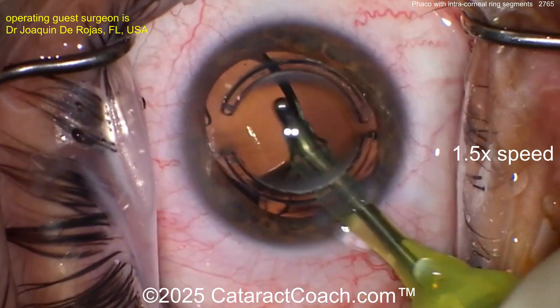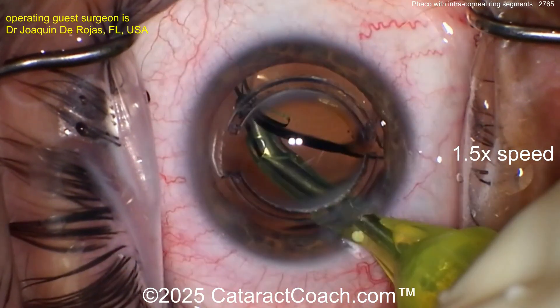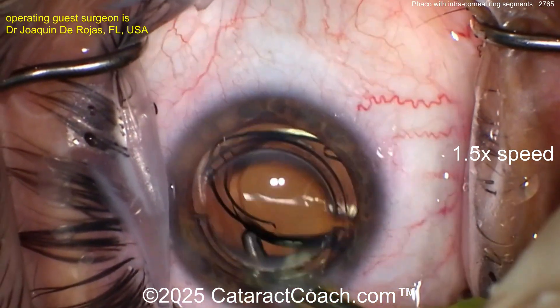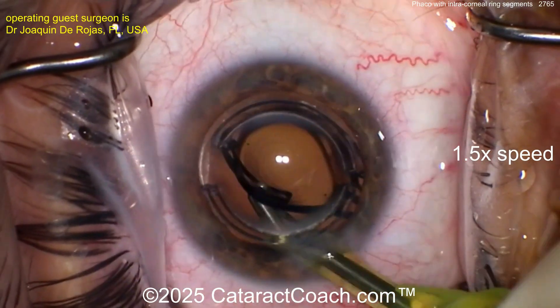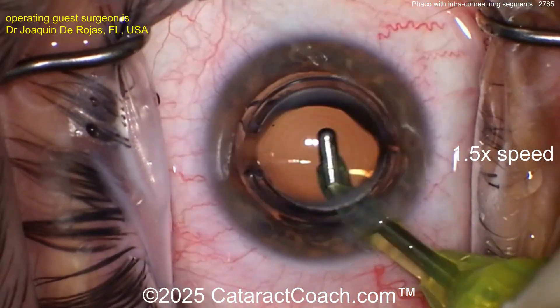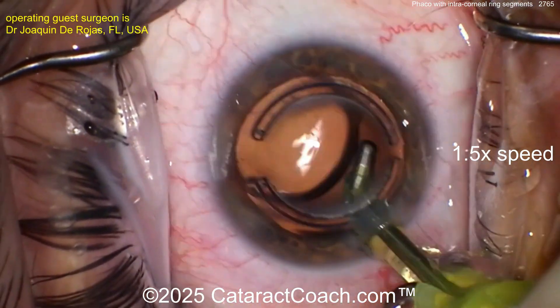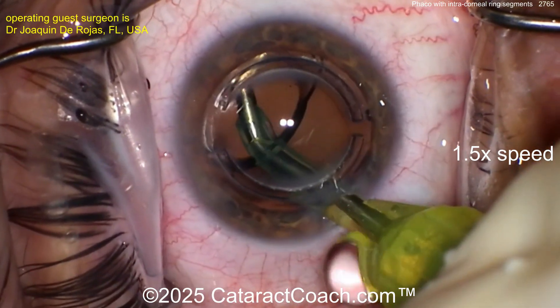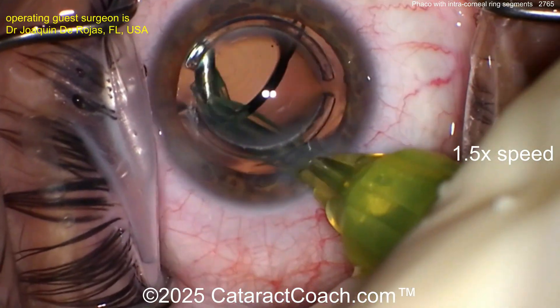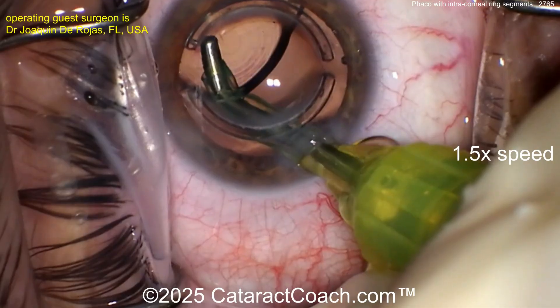Now, what should you do if you decided to take out the ring segments? You would remove them in one procedure, then wait — let the patient's cornea go back to a stable shape over the course of a few months. At that point you can do repeat calculations. But in this case, the patient elected to keep the ring segments in.